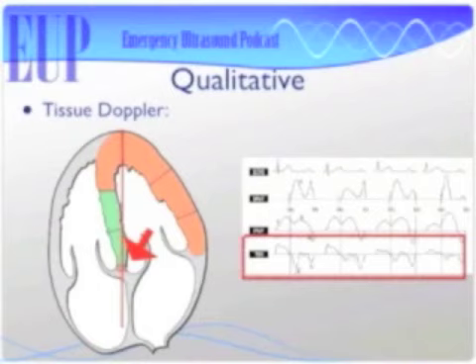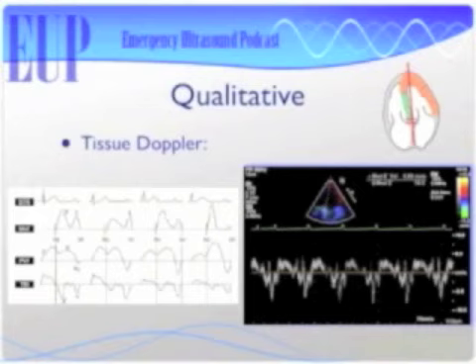done. And if it's not, then you take a look at the mitral valve inflow and figure out exactly how abnormal is it. Perfect. You like it? Yep. All right, we're doing good. So there we are. There's our TDI right there. You can see all the way on the left is normal, E prime greater than A prime. And that E prime should be greater than 8. That's considered normal, and E prime greater than 8.